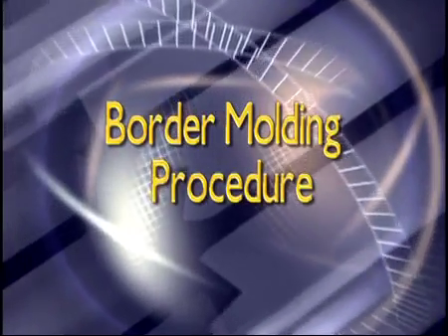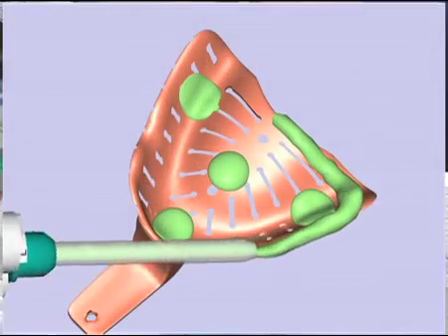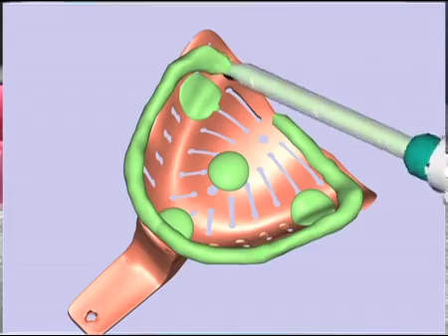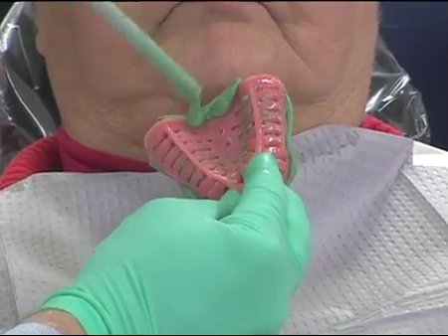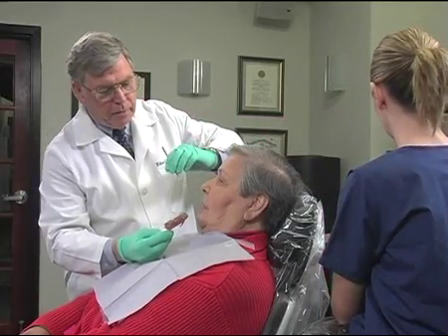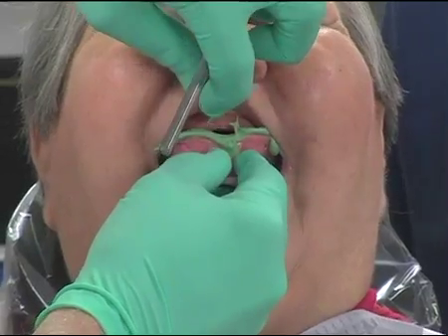Border molding procedure. Next, place a heavy viscosity PVS on the peripheral tray borders and along the post-palatal tray area. The heavy viscosities act like border molding wax compounds. Seating the tray is now easy and should prevent the operator from overseating due to the tissue stops previously placed.